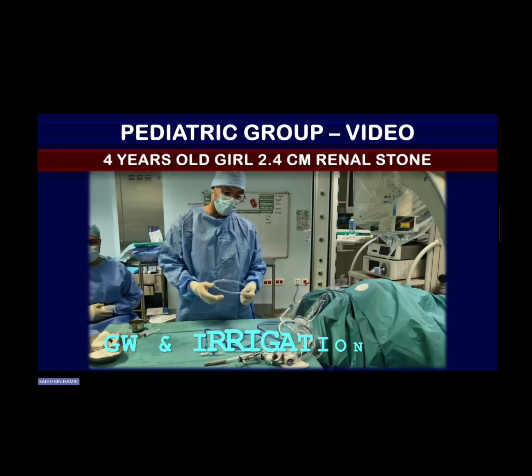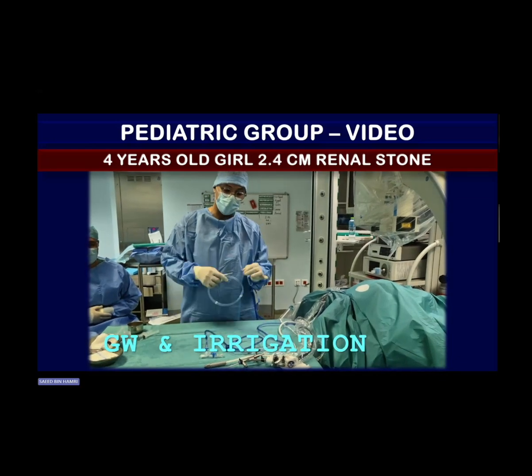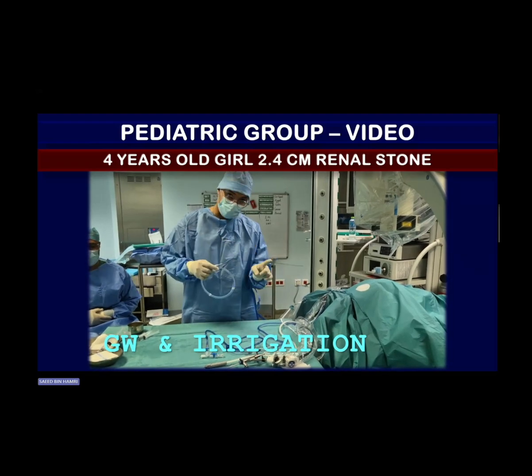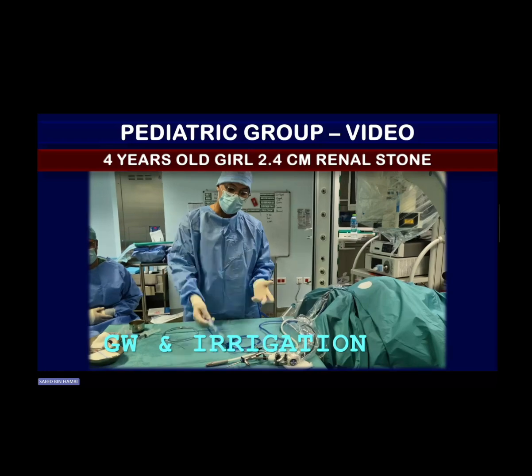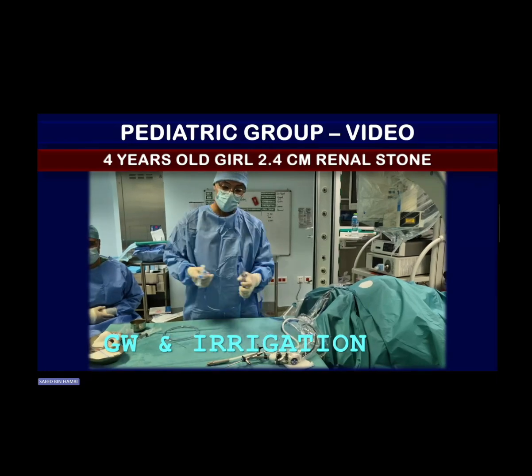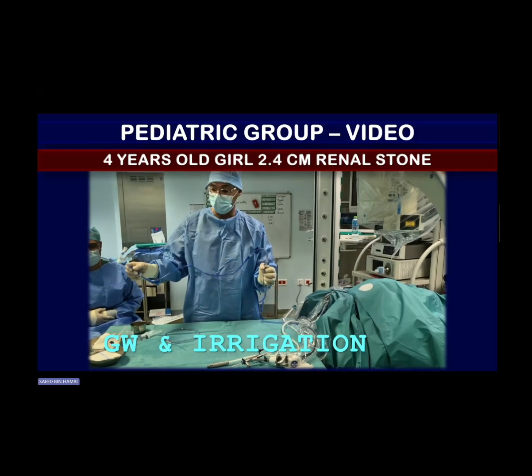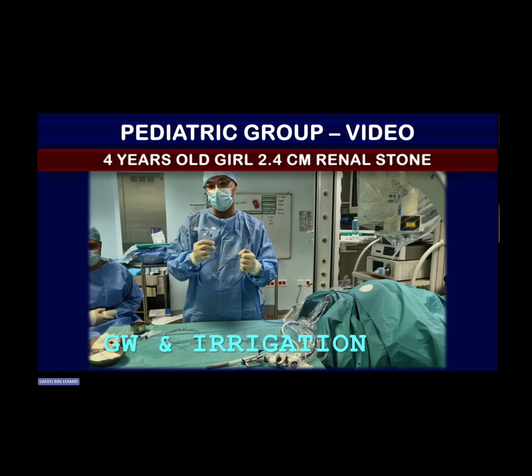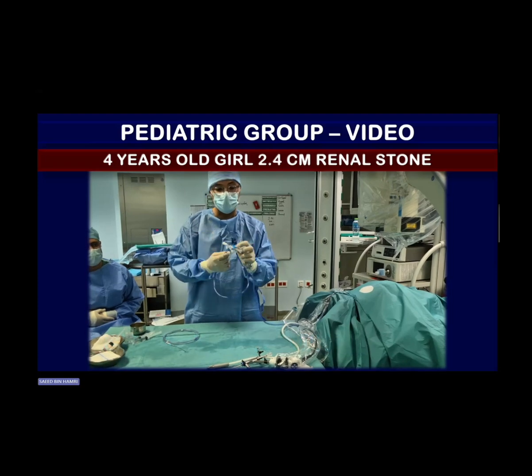Second stage, we prepare our material. One of the two main parts of the preparation is the guide wire. We use the hydrophilic guide wire, tip guide wire, one of the best hydrophilic guide wires, with a floppy tip about 6 centimeters. The second part is the irrigation system that we use. It's gravity-based irrigation with a manual pump, and the manual pump gives you some of the versatile irrigation to increase and improve the vision without compromising the high pressure over the upper tract.